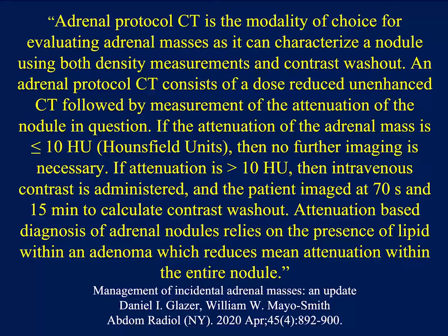Again, some of the pitfalls with washout I've told you about. Don't do 10 minutes for the washout. If the lesion enhances really bright, above 130, we don't care about the washout. It's going to be a pheo and not a rapidly washing out adenoma. So again, learn the rules. And again, we're learning how we can do better. We're learning how much of the adrenal evaluation needs to involve endocrinology and endocrine functions. And that's something I think with AI that we'll learn more about.